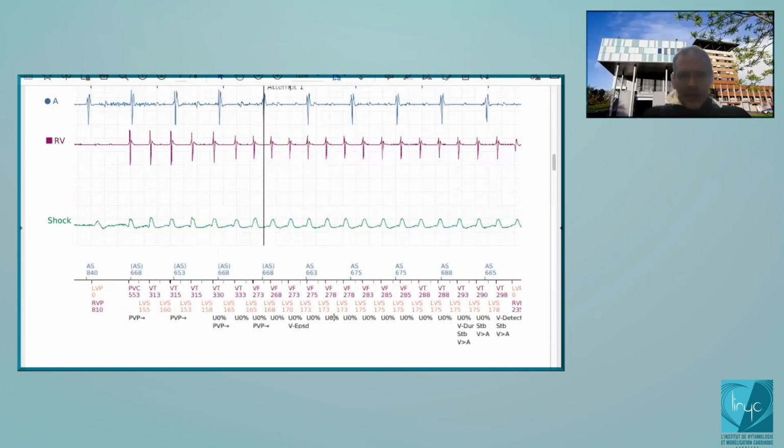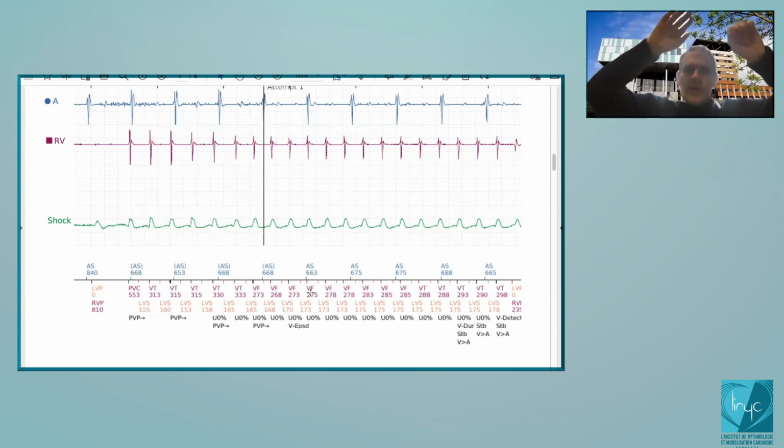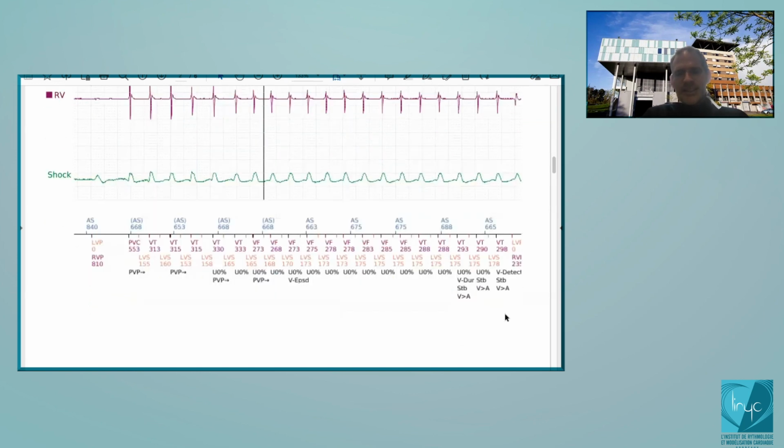So you see how it works, competition between the different zones. One cycle classified as VF will increment the VT counter. But if the VT duration and the VF duration are running in parallel, you will never treat as a VT while the VF duration is still ongoing. But if at one time this duration is not ongoing anymore, since you no longer have the 6 out of 10, then you can treat the VT with the ATP.